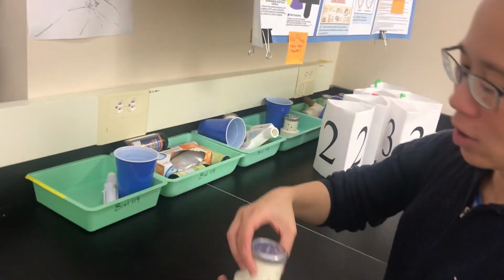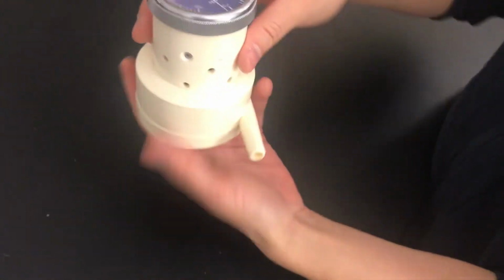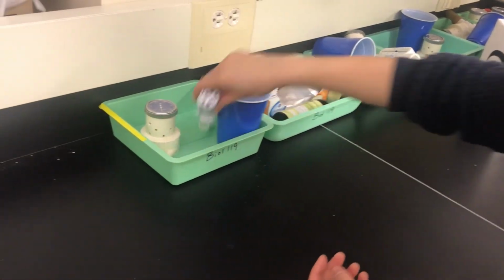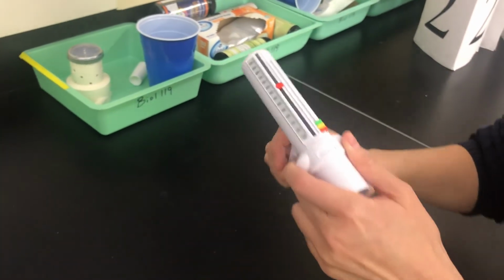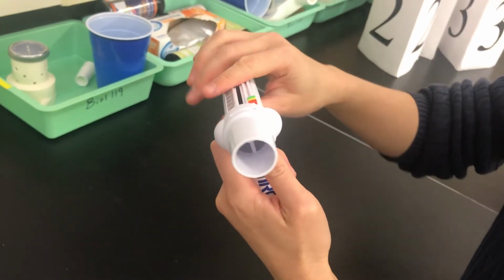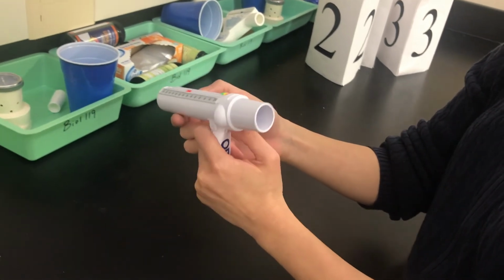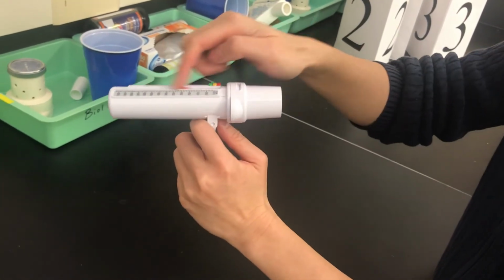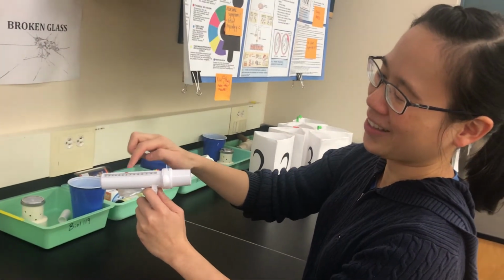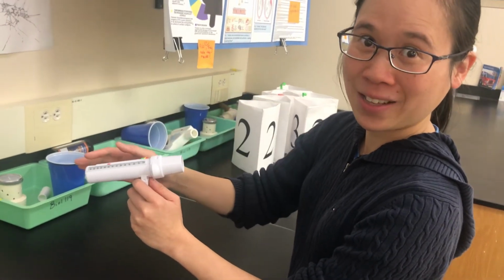stations for today. We also have a spirometer where you can check out what your lung volume is, right? All you need to do is blow into it with a cardboard tube. And then we also have a peak flow meter that will test whether or not you have asthma, because your airways will constrict or dilate depending on how severe your asthma is. So you put on a cardboard piece here and move that to 0, and then you just take a big bolus of breath and blow, and then hopefully the little marker will move and tell you how quickly, in liters per minute, you're able to expel that air.